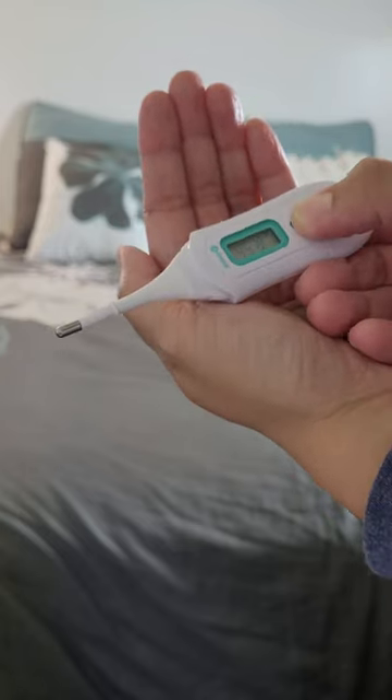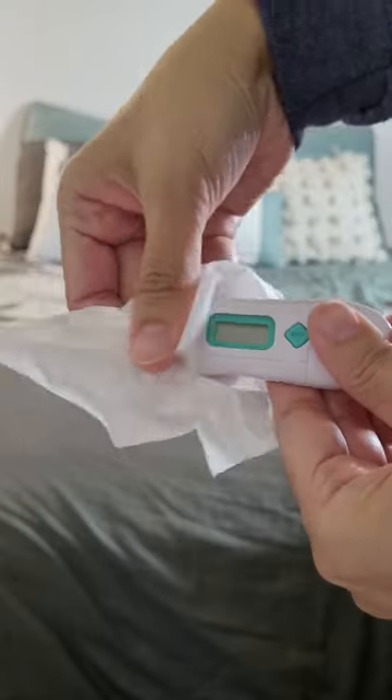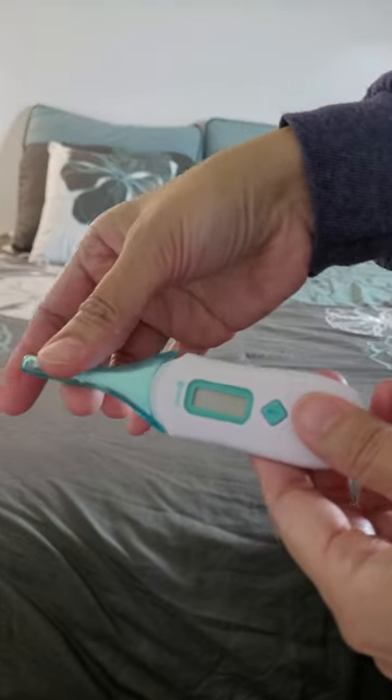Take the thermometer out from the baby's arm, then read the result. Clean the thermometer before putting it back in the case. Keep it in a designated area so you know where to get it the next time that you need it.